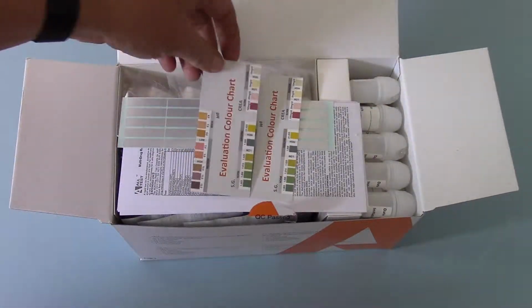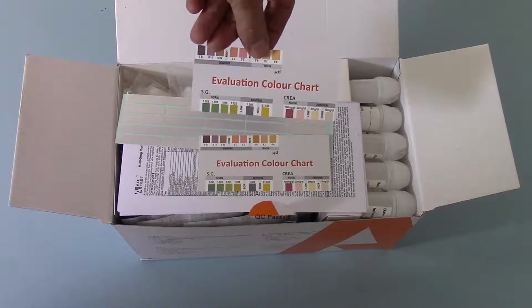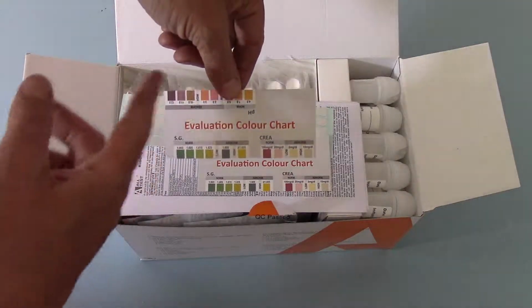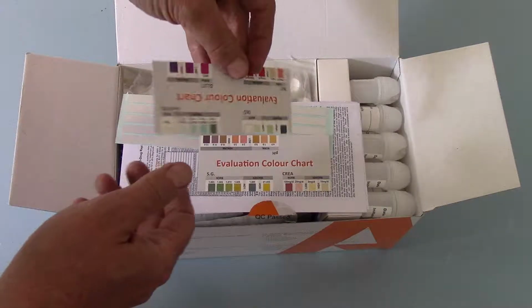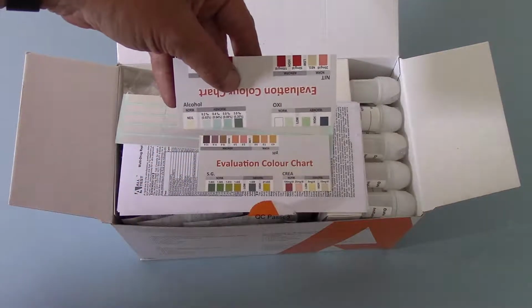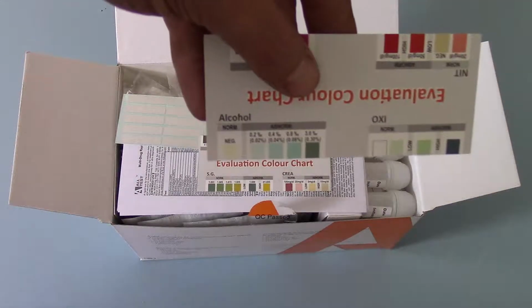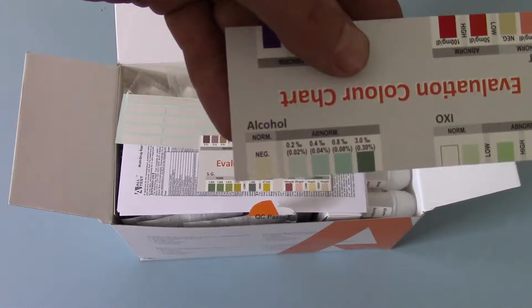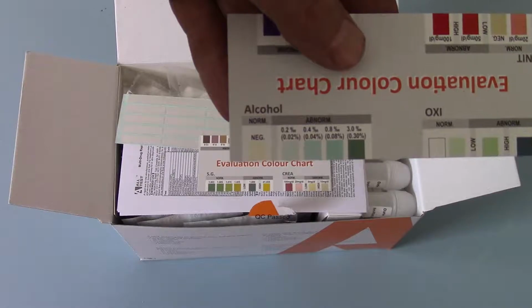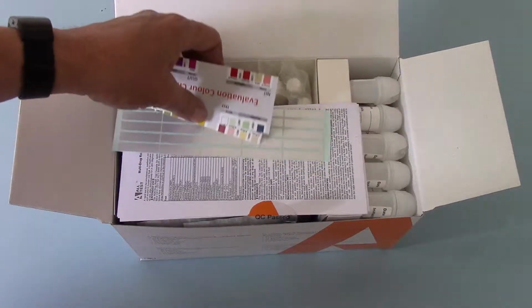First thing you'll notice in here is some valuation charts. These are multiple reading results. They do cover elements that aren't included in the saliva test, such as the urine adulteration readings. The one of relevance to this test is the saliva results panel here with the colour comparison charts. If I just bring that up so you get an indicator of it. The darker the colour turquoise that the pad for alcohol detects, the higher the concentration of alcohol. A couple of those are included in here just in case one goes awry.